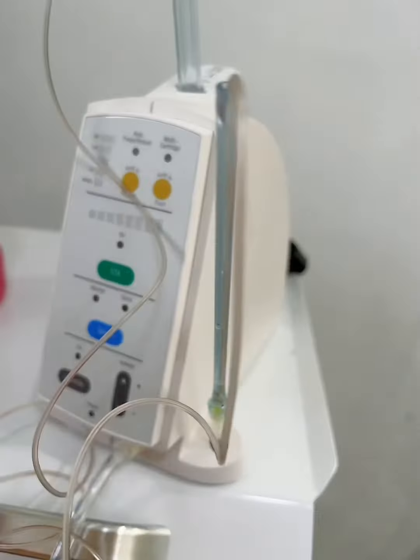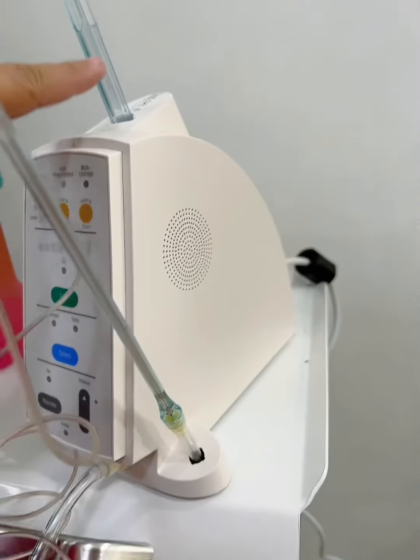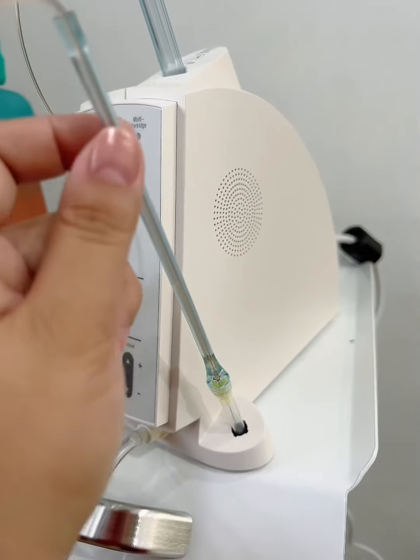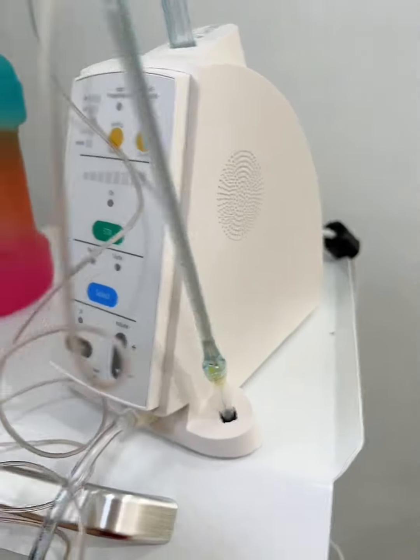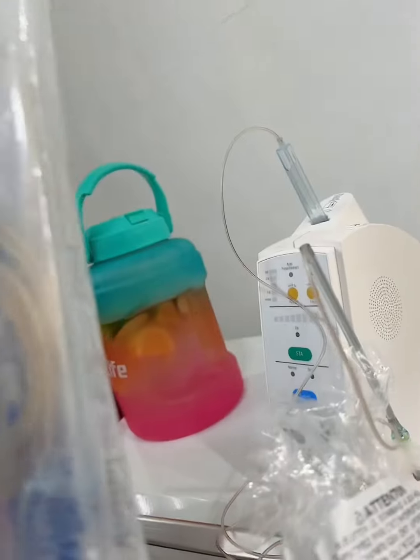So, you only change the cartridge here and the needle. So I can use this many times. And I still have extra pens or holders. Yes, that's all. Bye-bye.